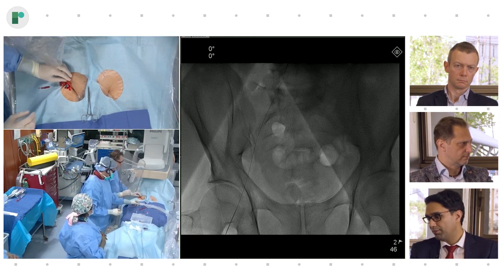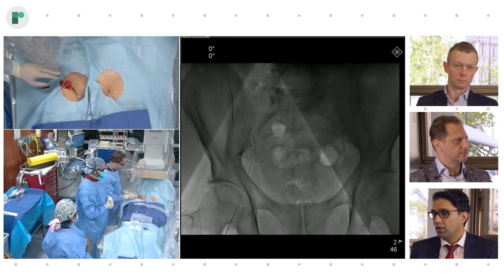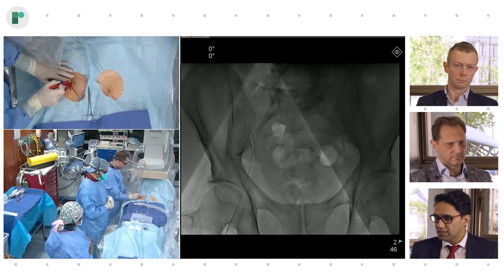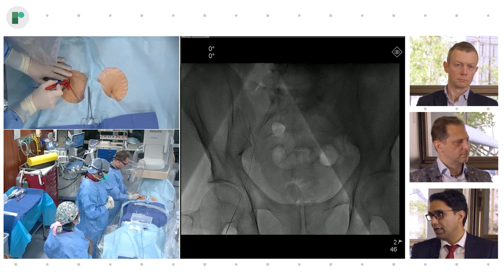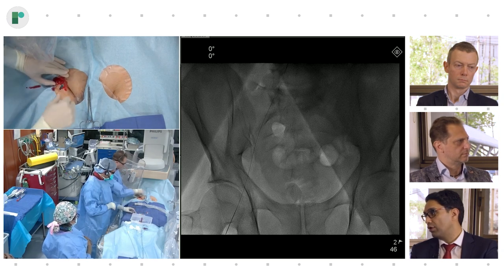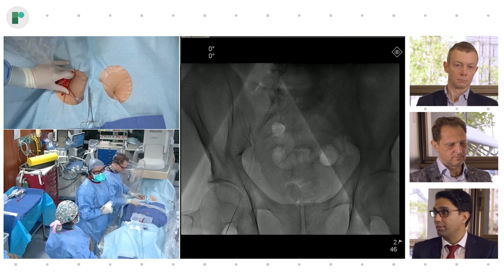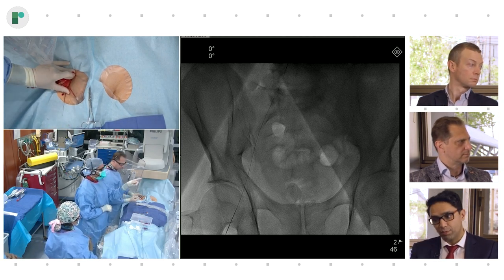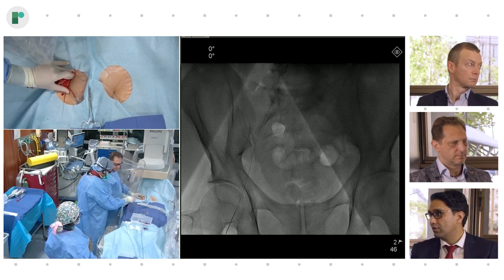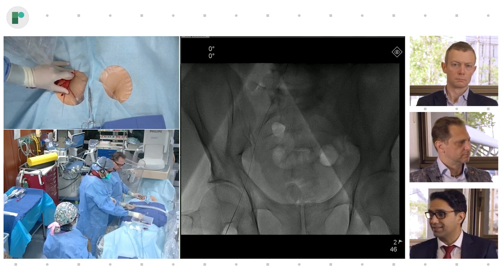So let's talk a little bit maybe about radial versus femoral in this clinical scenario. One of the reasons why we've somewhat stepped away from radial in these zero contrast patients is the potential need to use the radial for a fistula in the future. I mean, obviously this patient's creatinine is, I think, 3.85. As much as we want to delay this, there may be a time that their patient's going to end up on dialysis. Certainly we don't want to hasten that.